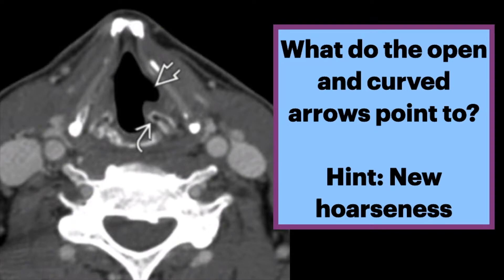In this axial CT, we see slight medial rotation of the left arytenoid cartilage, as indicated by the curved arrow. There is also a prominent dilated left laryngeal ventricle, indicated by the open arrow. This is sometimes referred to as the sail sign, because it mimics the spinnaker of a boat.